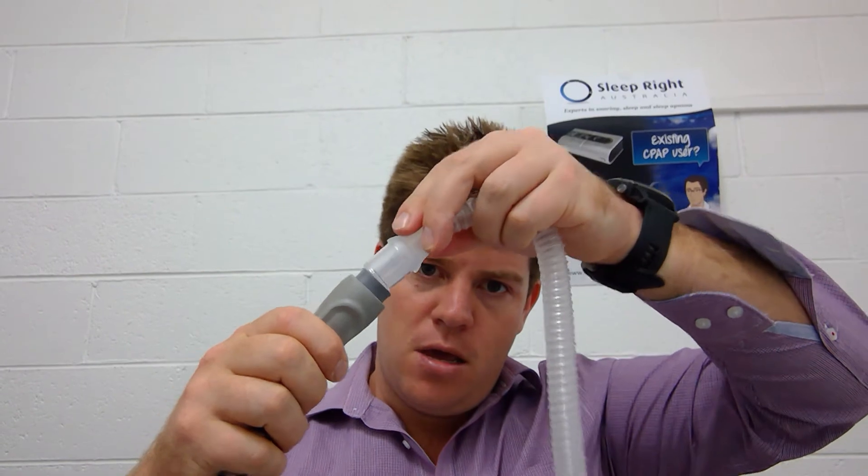All CPAP masks are compatible with CPAP tubing. A common thing we find is that people will leave their old connectors from their old mask in their current CPAP tubing, and when they go to put their new mask in, it won't go in because the connector is still there.